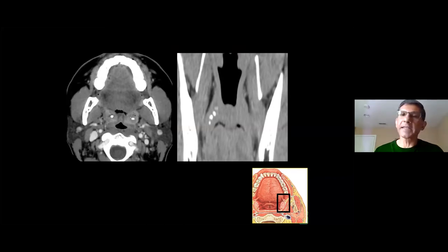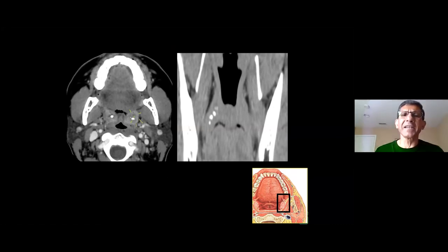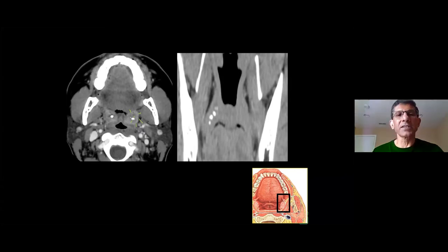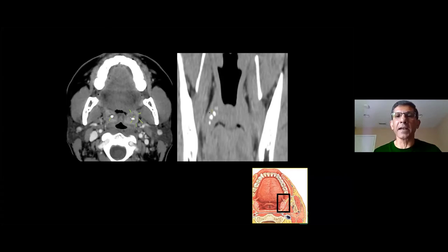Here's a patient with bilateral tonsilloliths. The tonsil looks bulky with enhancement and almost appears aggressive, but tonsilloliths are small calcifications from a chronically inflamed tonsil. When you see these calcifications with thick enhancing tissue circumferentially and symmetrically surrounding them, in most cases this is just chronic inflammation associated with a tonsillolith. Tonsilloliths can be unilateral, bilateral, or multiple.